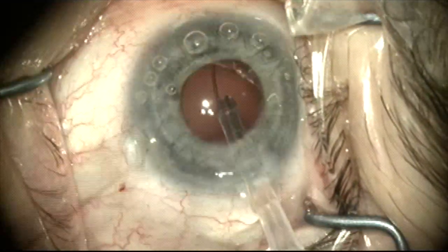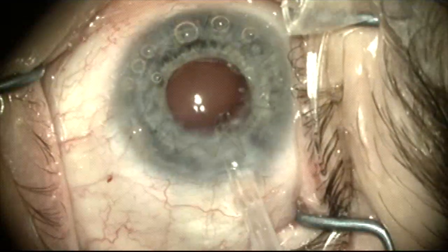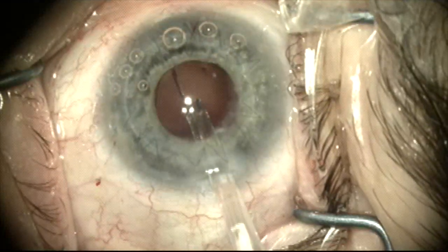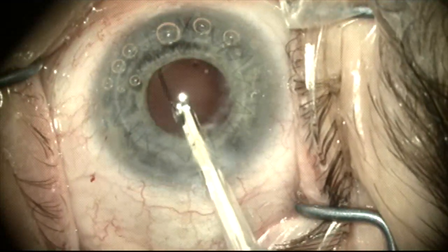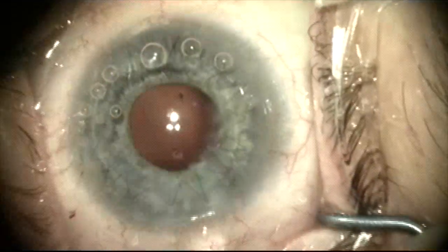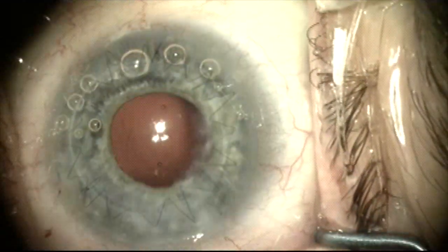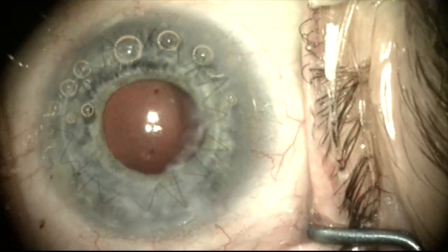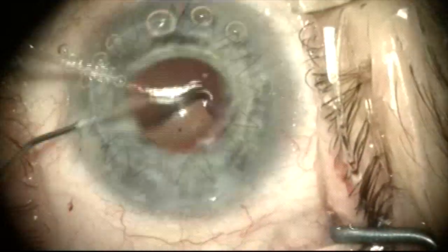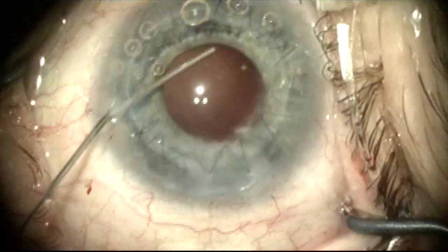Now that I've ascertained that I'm in the right place, I'm going to inject the capsule tension ring into the capsule bag. When I do this I can see a little change in the reflex coming from the posterior capsule. And after the ring is injected I inspect the posterior capsule and see that there's actually a posterior capsule tear or split that has occurred during injection of the capsule tension ring.